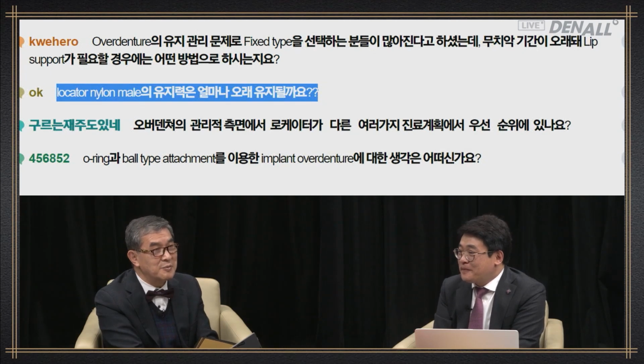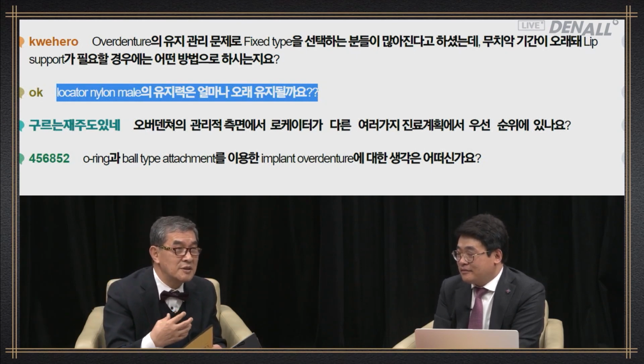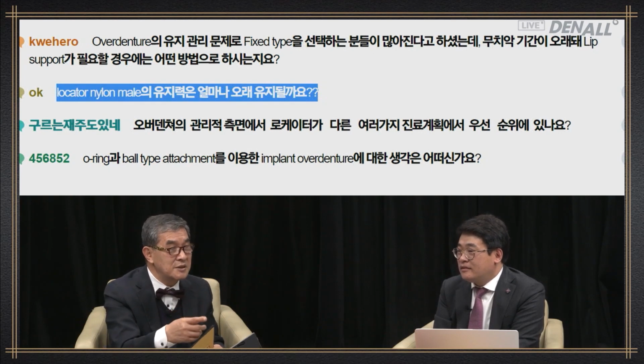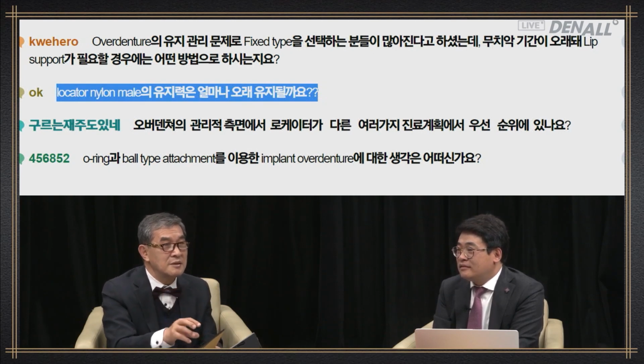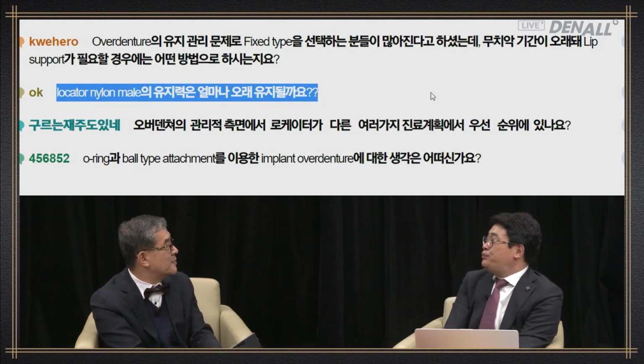As you have mentioned, it varies depending on the patient. In most cases, I believe patients use up to 1 year, and they come back and say that it's loose. And as you have mentioned, we change from blue to pink. That's the general way to approach it. And that's what we do.